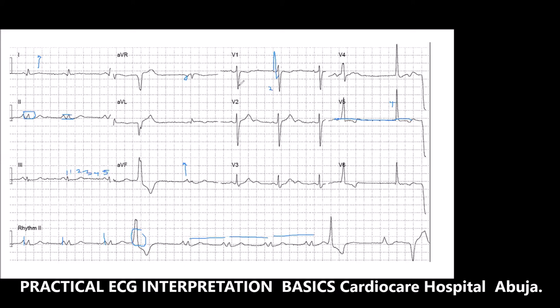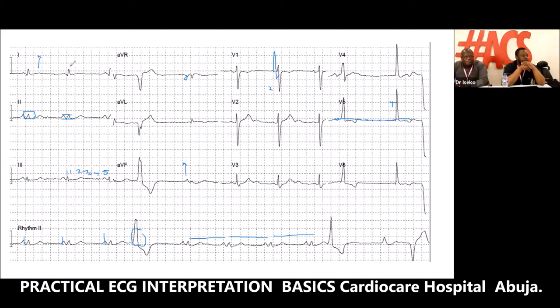All right, great. It just reads in the QRS complexes. You said they are low voltage. Yes, in the limb leads. So when you go and look at the echo, you find what the problem is. Yes, you have to do the echo. Like we said during the previous lectures, everybody has the potential to have an echo. With the ectopic beats that we have, once you have an abnormality on ECG, you should do an echo to look at the heart.